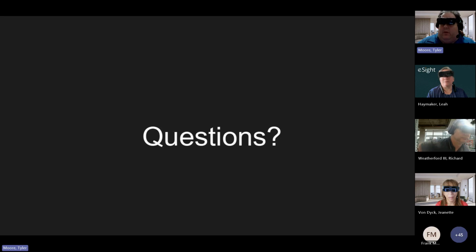On 5.0, it'll be in a menu item. So when you go to the menu, after the volume, the mode. The mode, sorry, yeah. You choose exposure, and then the exposure will have a number in the upper right corner of the screen, and then you can increase or decrease the exposure by adjusting the arrows. So the exposure can be adjusted similar to the zoom.